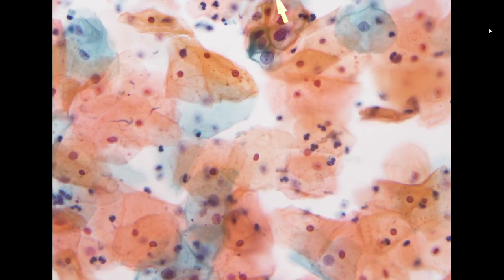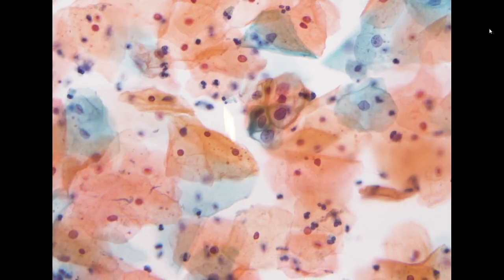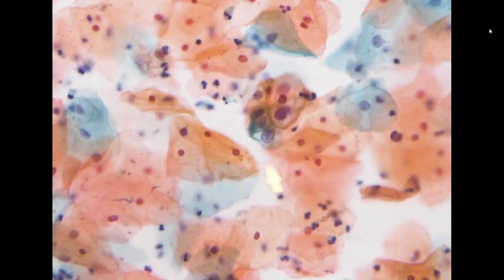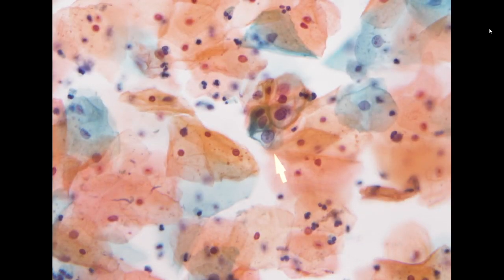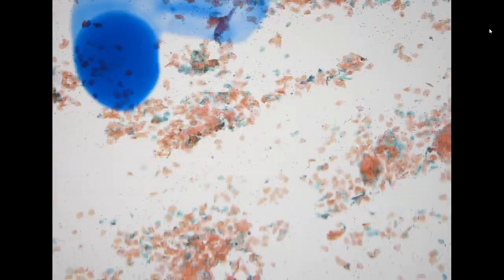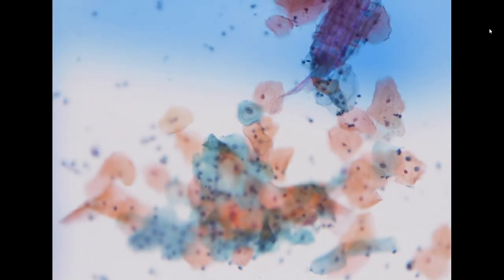I'm actually debating: should we call these LSIL or should we call these ASC-US only? Because the patient has a prior biopsy, which is negative again, for this case I decided to call it just ASC-US. But if somebody wants to call it LSIL, I think it's also okay. Sometimes when you call it LSIL and there's no biopsy-proven lesion, that would be quite problematic for the clinician or for the patient. They will worry too much. So I still decide to call these ASC-US. Okay, so this is an ASC-US case. Okay, that's for today.